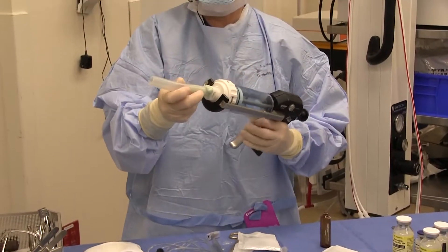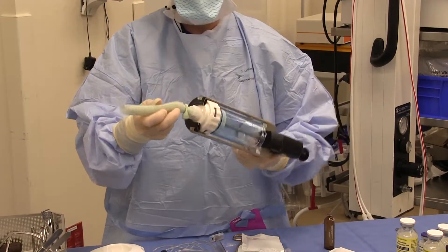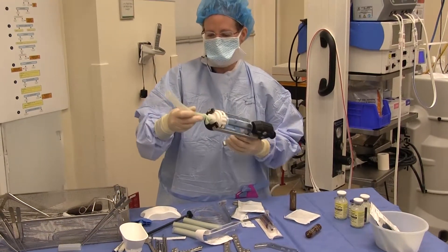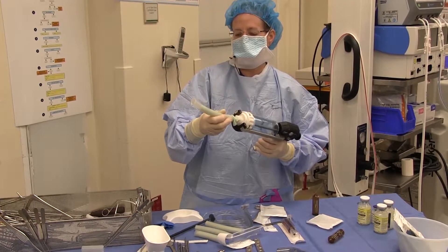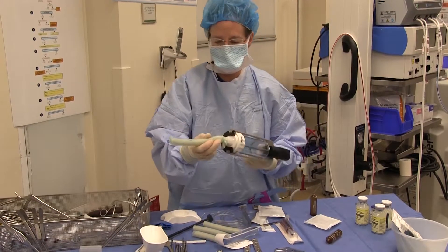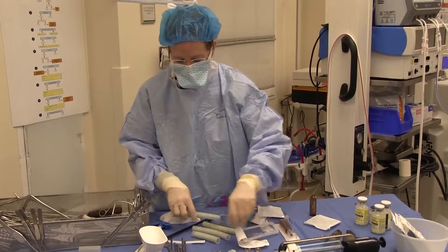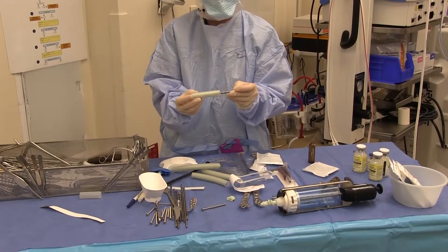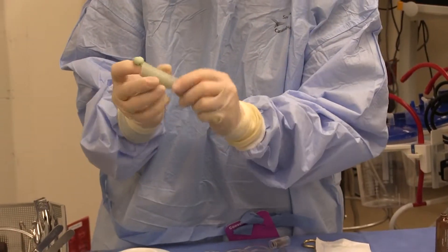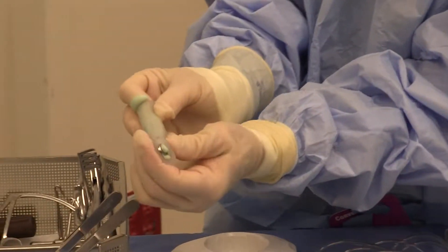It just makes it easier to use a cement gun to fill the tubes. So now we'll first start — we can put this little plate in and just sort of stick it in there, and then you'll be able to see through the silicone tubing and you can cover the whole thing.